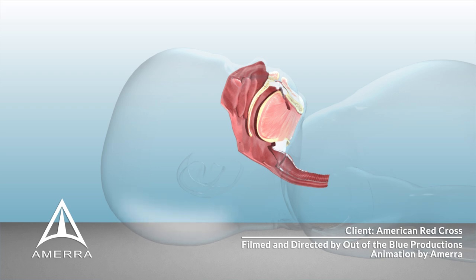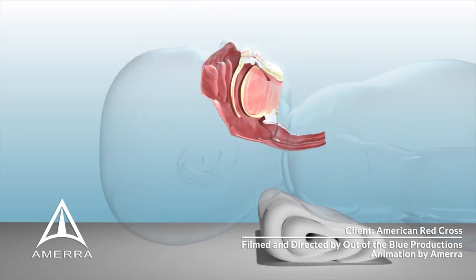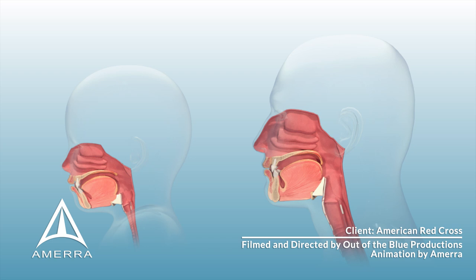Children and infants have a large occiput, which may cause neck flexion when they're placed in the supine position. Accordingly, it's preferable to use the sniffing position in children and infants. In small infants, use a rolled towel or a folded diaper under their shoulders to raise the chest relative to the head. The tongue occupies a greater proportion of the oral cavity in children than in adults. This may require an oral or nasal airway adjunct to alleviate obstruction.